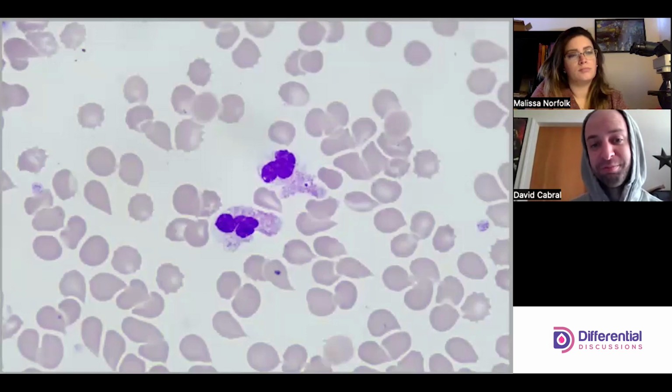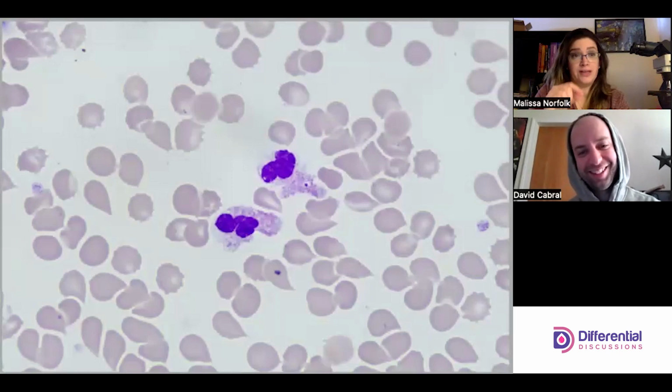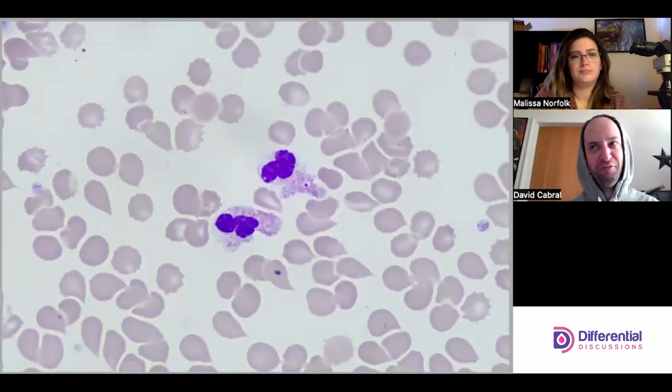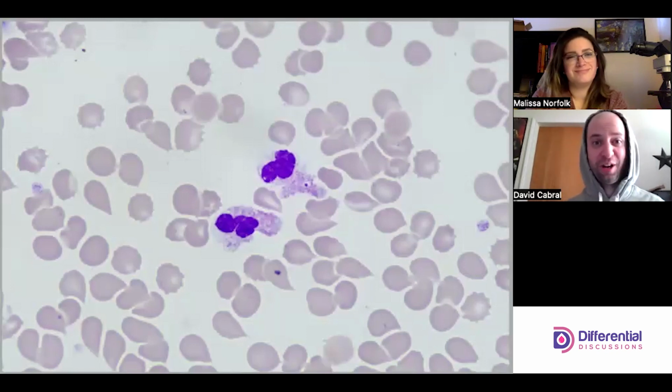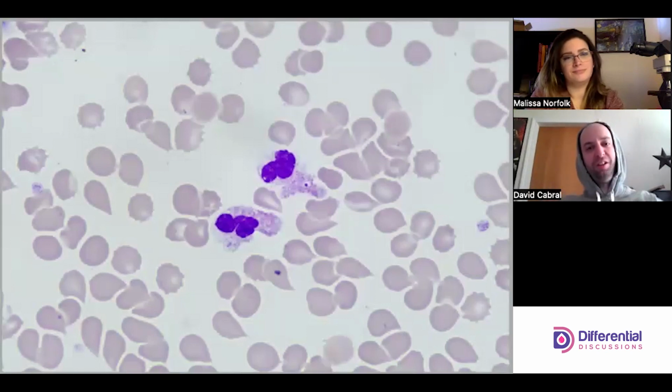So it's a dead giveaway, seeing DNA in a vacuole in the cytoplasm of a neutrophil, that you have something like an anaplasma. And they usually form little morulae in the cytoplasm. Yep, exactly. You may hear the word morulae, and that's basically a little colony of them forming inside of the vacuole. They've evolved to evade the destructive properties of these cells, so they can wall themselves off, replicate, kill the cell, and do their thing.